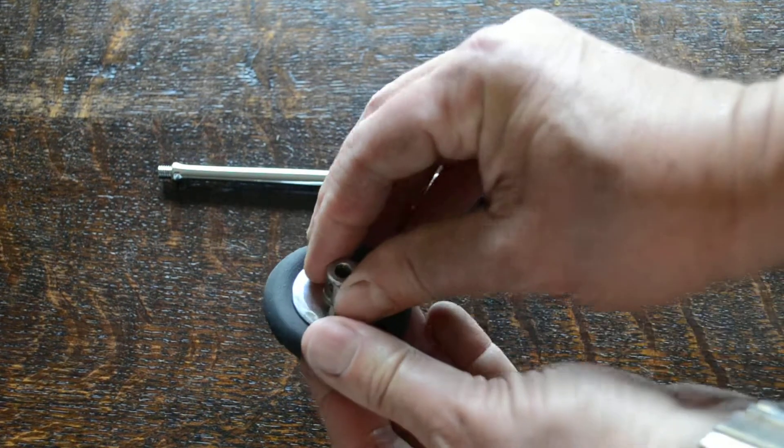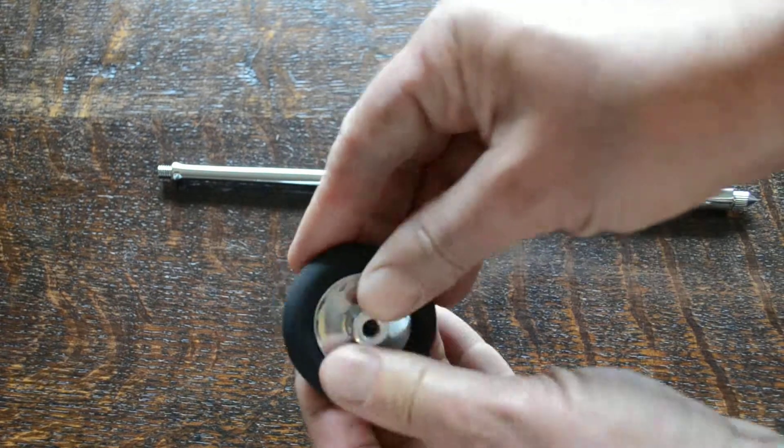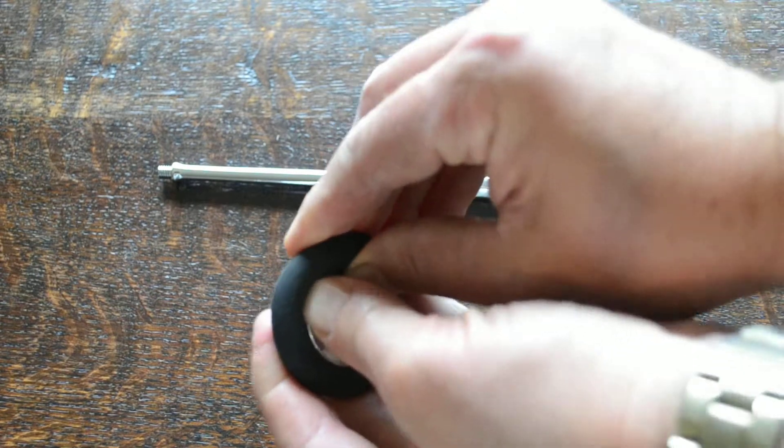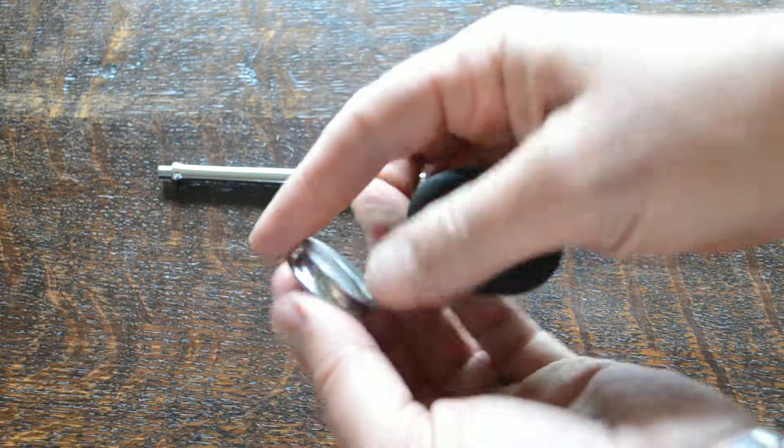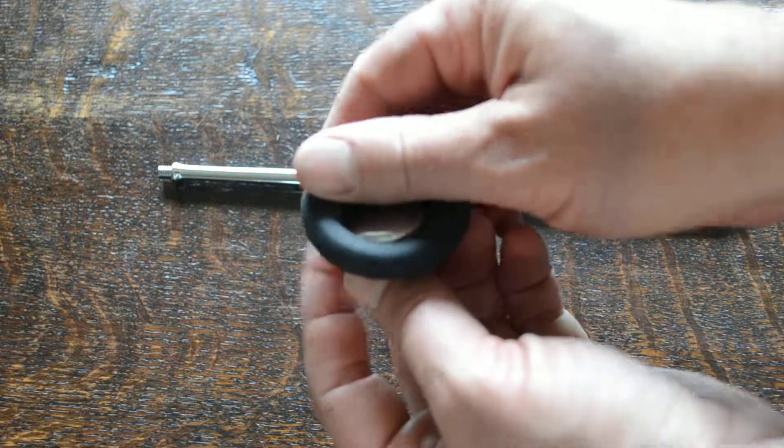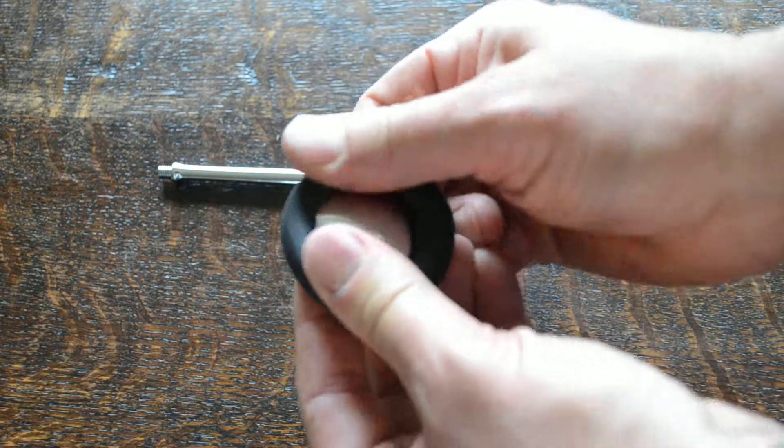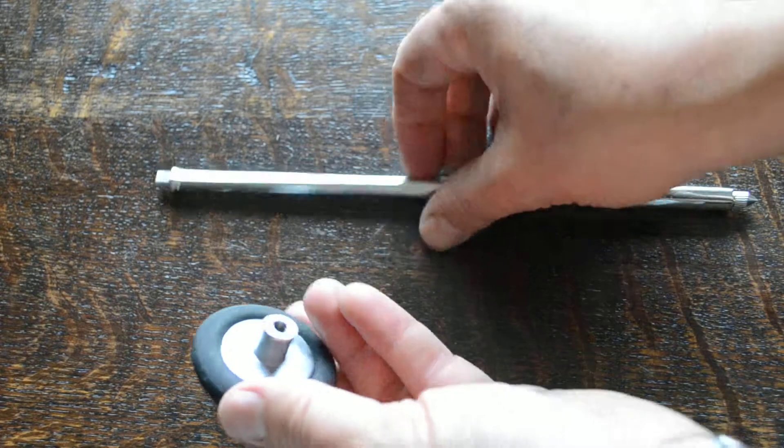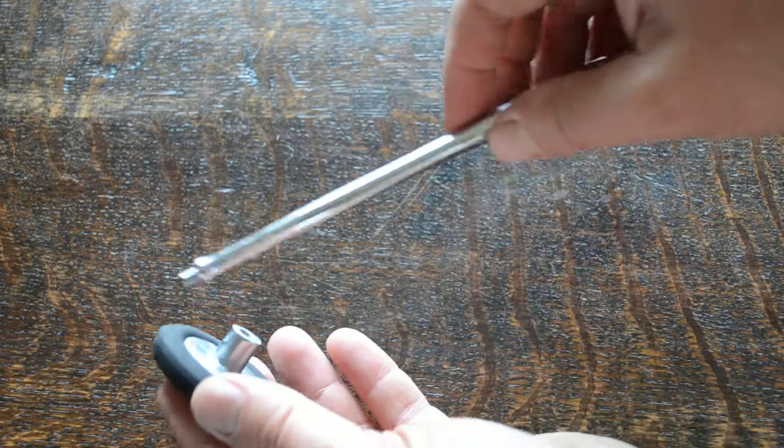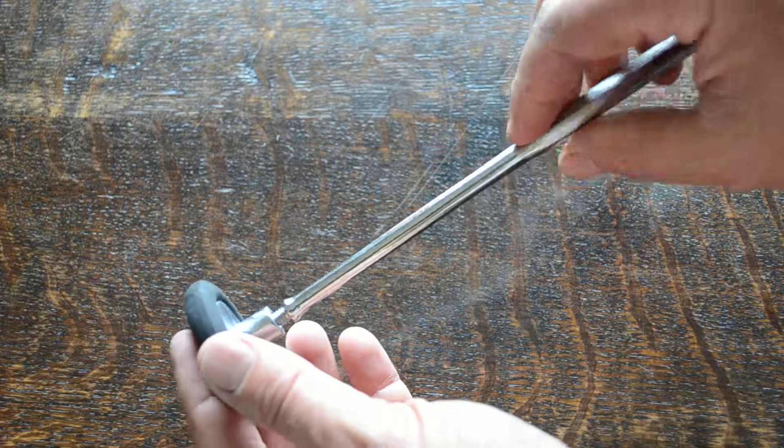It's got a removable latex hammer head which can be removed for cleaning the surgical steel hammer head. That can be replaced and then you've got two options with this hammer.